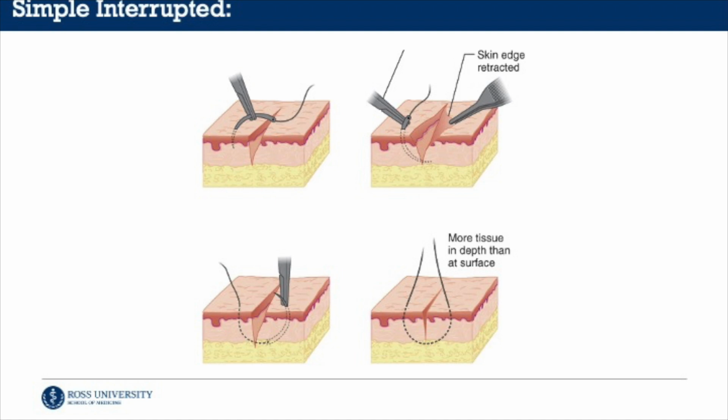The path of the needle will be on an arc, but to help create wound edge eversion, you will pull the skin towards the midline of the wound before taking a bite with your needle, which creates an Erlenmeyer flask type of look, as you can see pictured here.